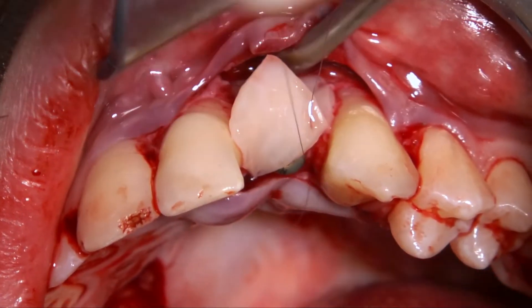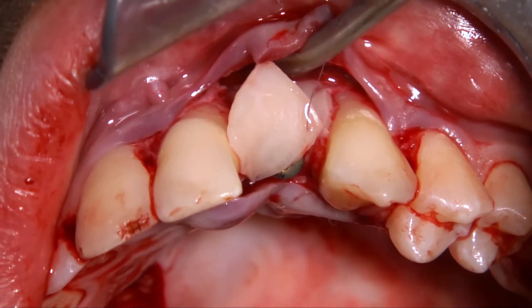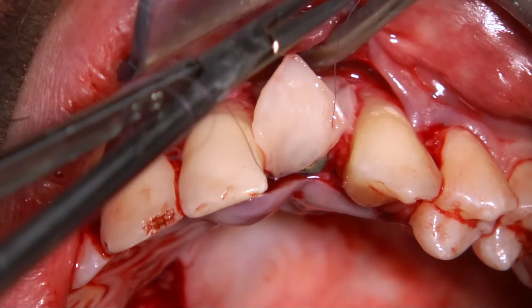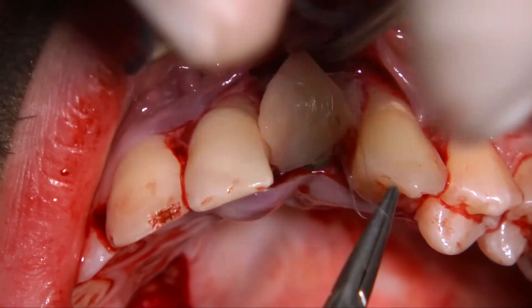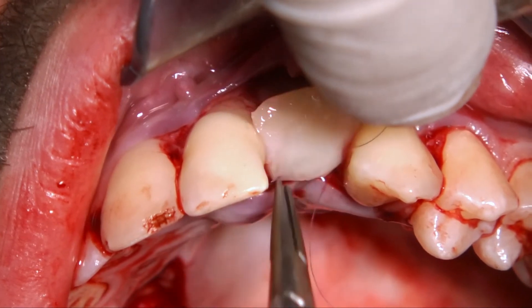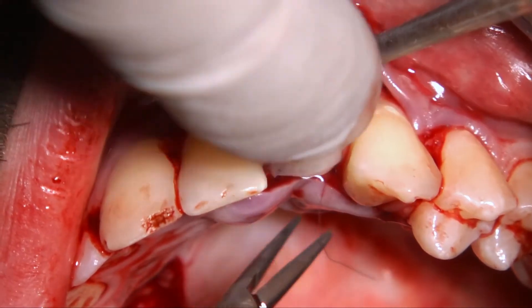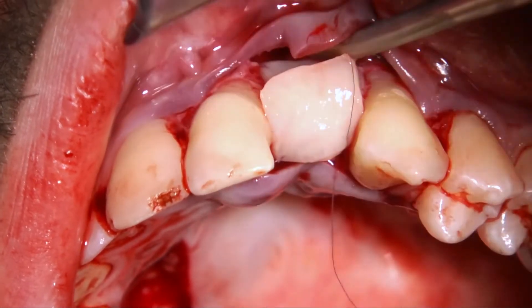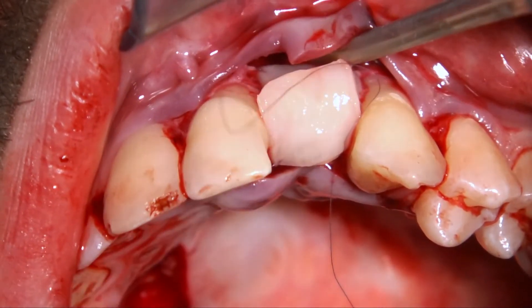Theoretically, the healing cap would keep the graft even more coronal, and this could increase even more the papilla height.